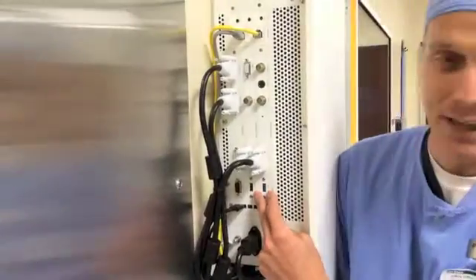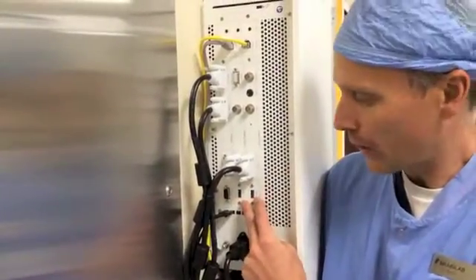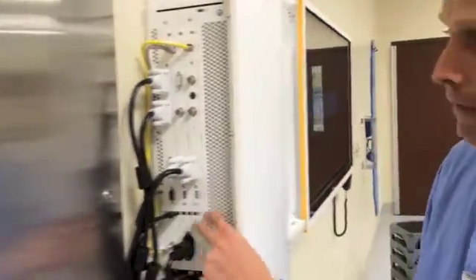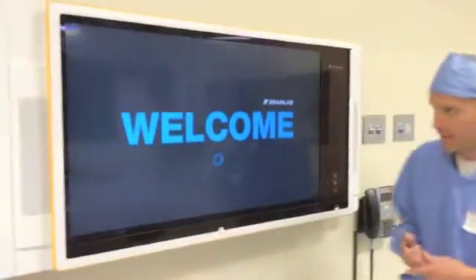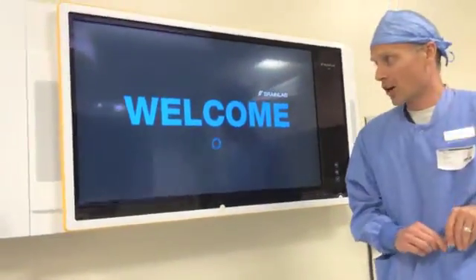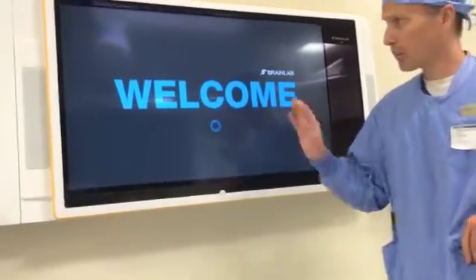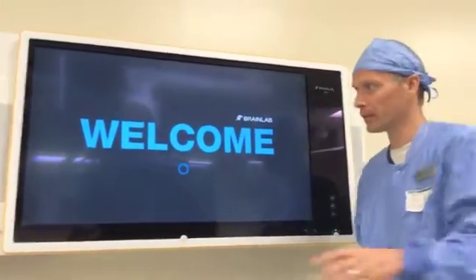This would be for manual data loading, or if the doctor's bringing images from his clinic and has it on USB, we can load them up through this port as well. Here's the welcome screen. As I tell everybody that's gone through the training the last couple of days, don't be afraid to touch the system — there's nothing you can do that's going to affect what's happening in the surgical field.